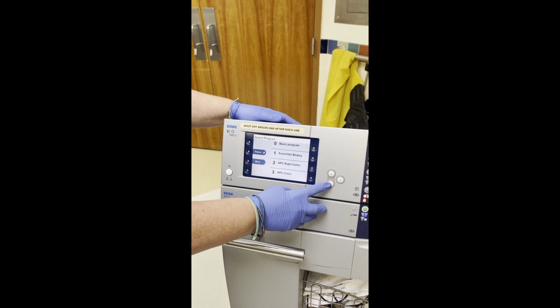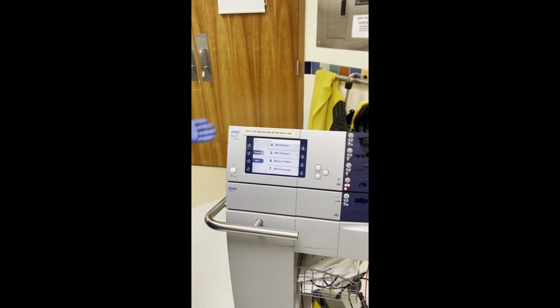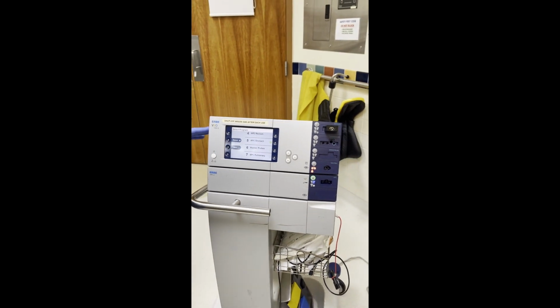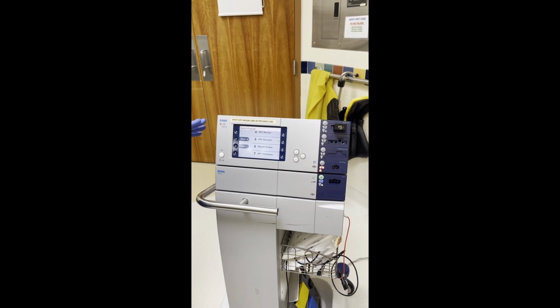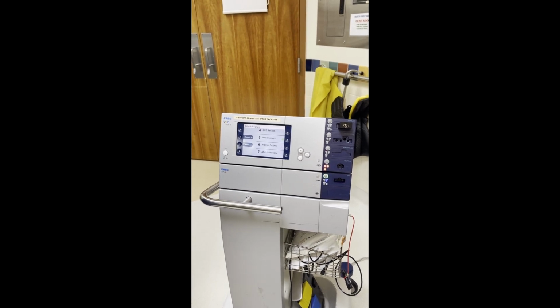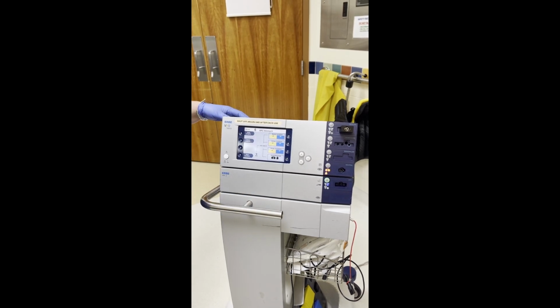Now, these settings are preset as far as the watts and the coag and all that kind of thing. So you don't have to think about it. You don't have to adjust it. But if they have an ulcer, just think it's in the stomach. So go to APC stomach and then just hit there.